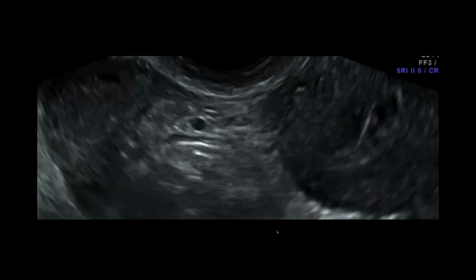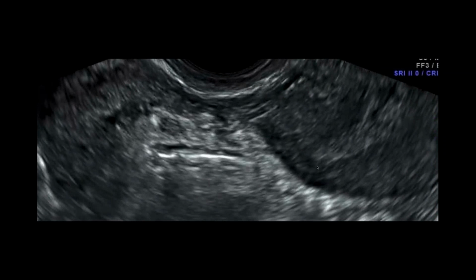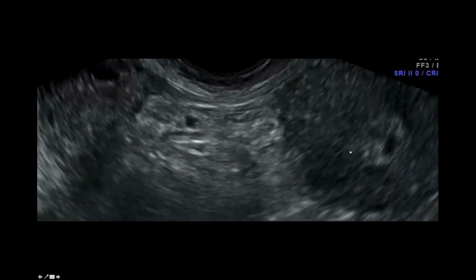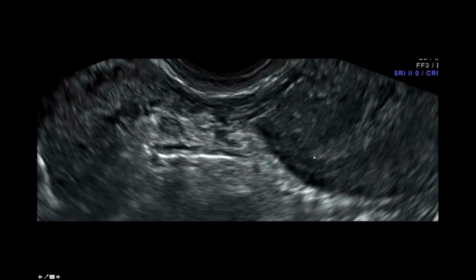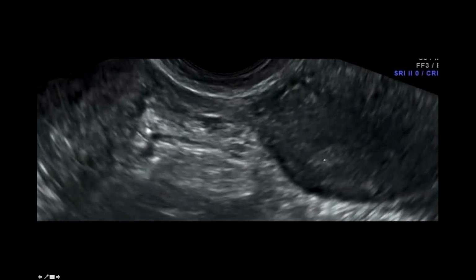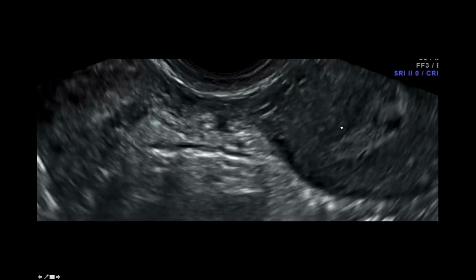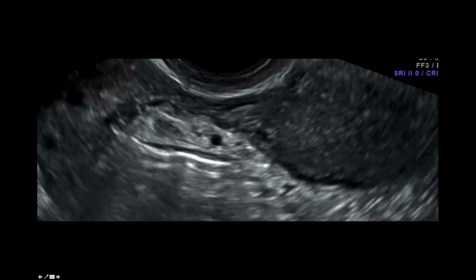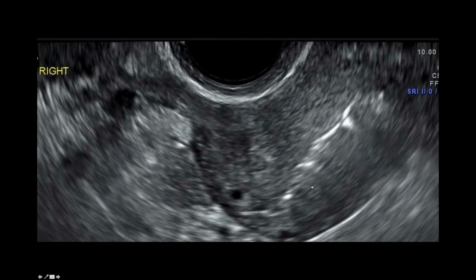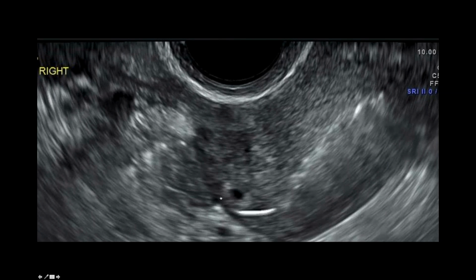All right, so here we go. We're looking here. I'm following the endometrium to the cornu, so I'm thinking that the tube is going to come out through here. I can't see the tube, but I'm figuring out the best place to look. I can see my uterovarian ligament and my ovary, so I'm going to focus here as I inject the air and saline. And here we go. You see the bright white is the air. The water pushes it out, and you can see it's coming out through here.